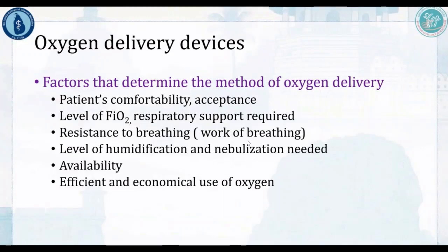When to decide and what device to use is a medical decision. The senior doctor or the consultant will decide on that. But several factors are involved in deciding what device to use: patient comfort, level of FiO2, resistance to breathing, level of humidification, availability, and efficient and economical use of oxygen.